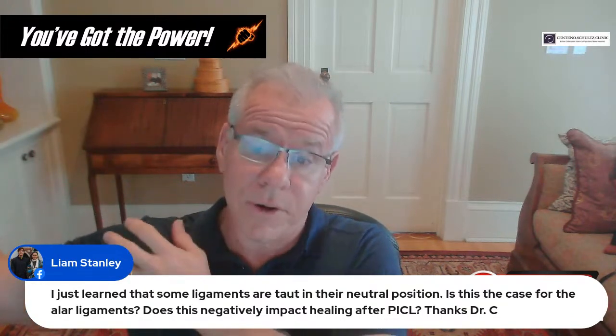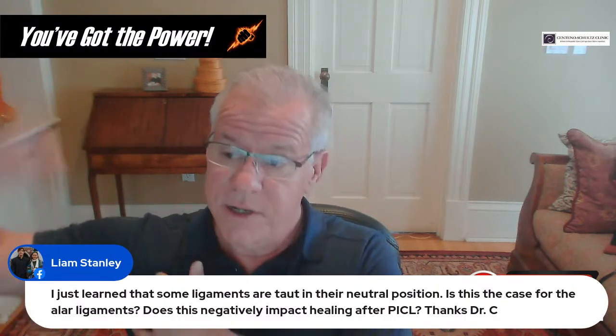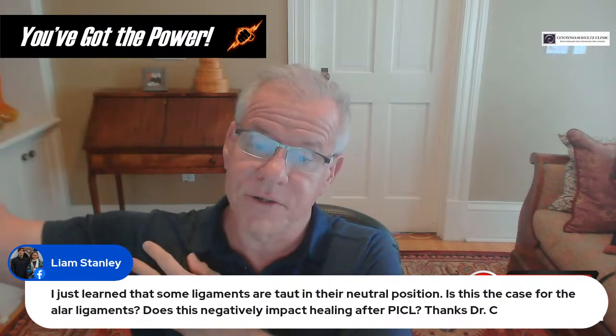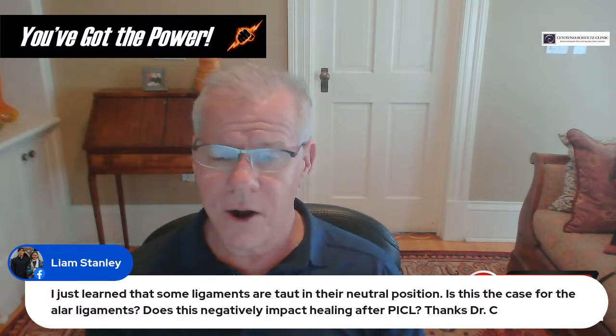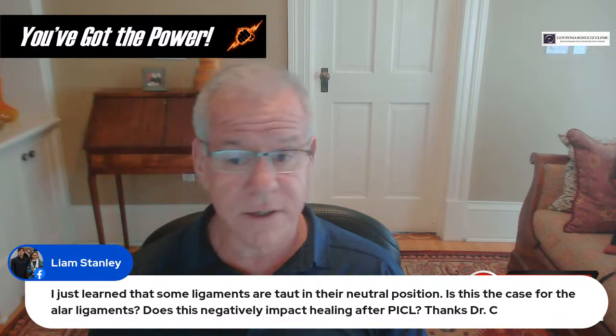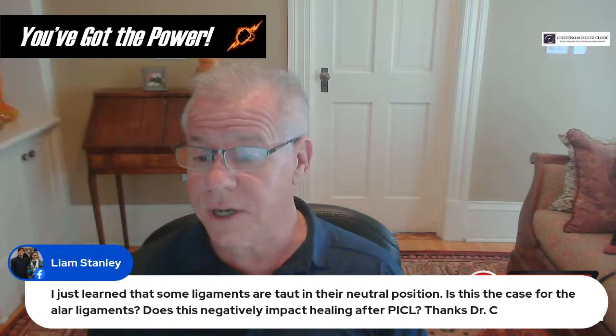So the front of the shoulder capsule has folds, and that allows a lot of motion. The folds are accordion-like here, and then the accordion gets stretched out as I externally rotate. As far as other ligaments like the alar, those should be taut. I've never seen a picture of the alar ligament where it was loose and normal.